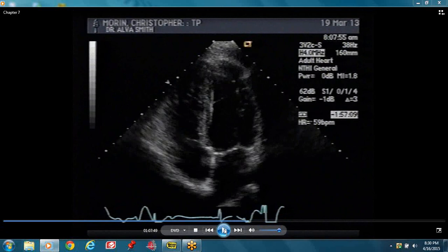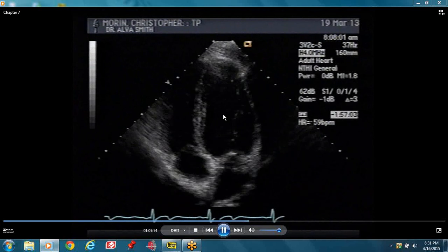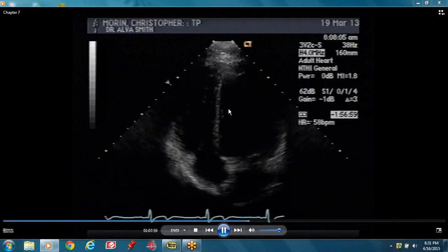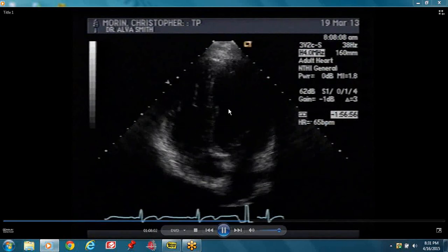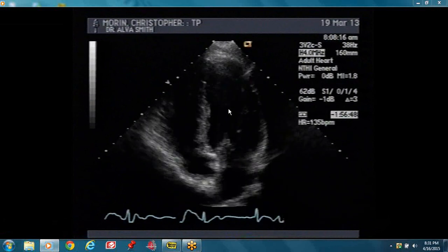The heart does a number of things. It has a longitudinal motion where the base moves up towards the apex. It also moves in a circumferential motion and it thickens. It also has a torsion movement. You can see the base moves up and comes in towards this pointer. A normal muscle thickens in systole — that's what you are going to be looking for.